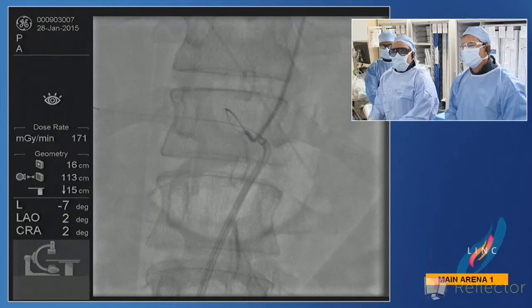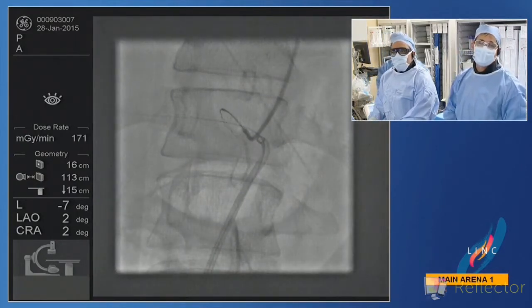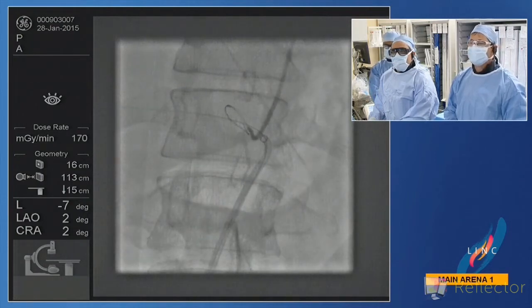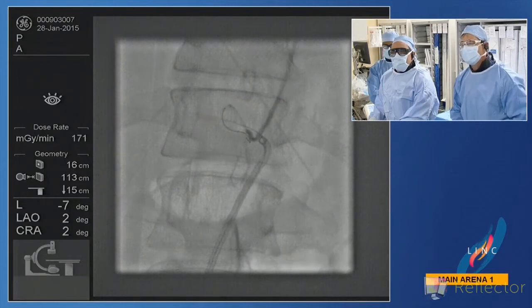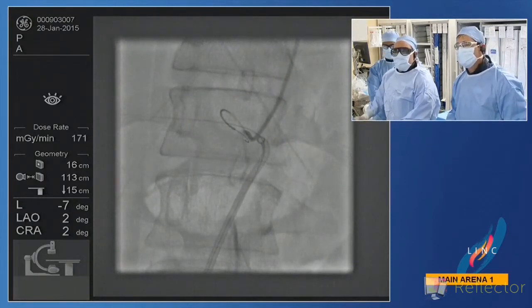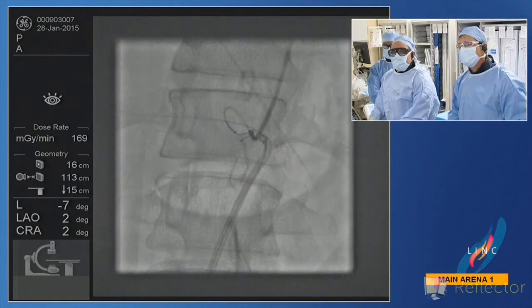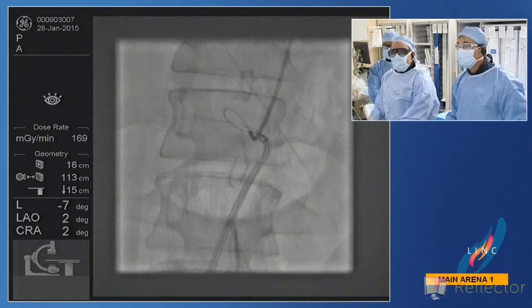So just give them a minute here to do their job. It's funny, it popped into the splenic off camera. Obviously now that we're on camera, it doesn't want to behave the same way. Some of that may be that our wire in the hepatic is changing this morphology a little bit. Let me get you some sort of oblique here.